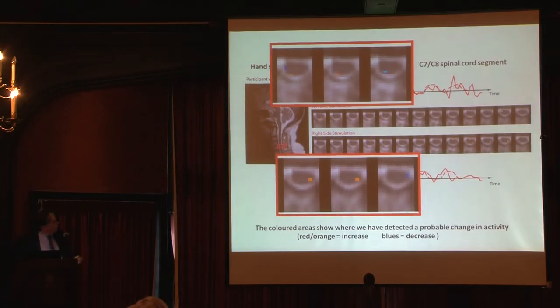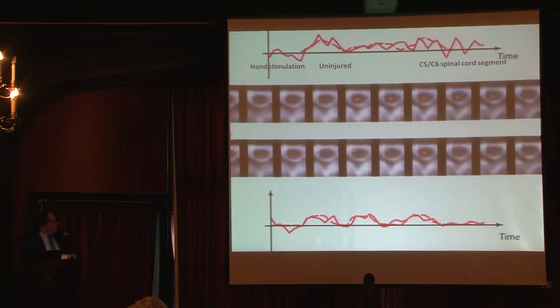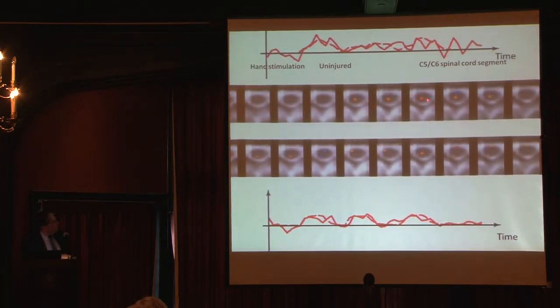And just trying to highlight, you can see these areas, they're colored in. So hopefully, I always get comments at the end of my talk that I couldn't see the little colored dots. Well, hopefully you can notice them now. There are the areas that are responding with these time course patterns. And we can see responses that are distinct for right or left-hand stimulation.